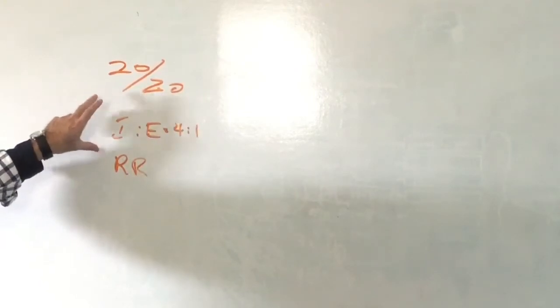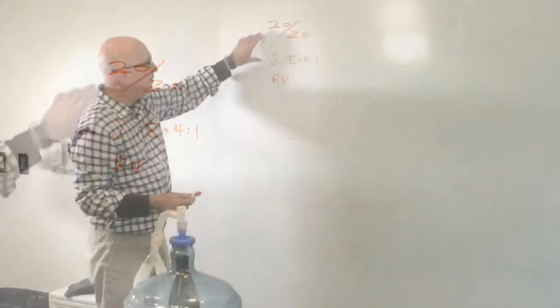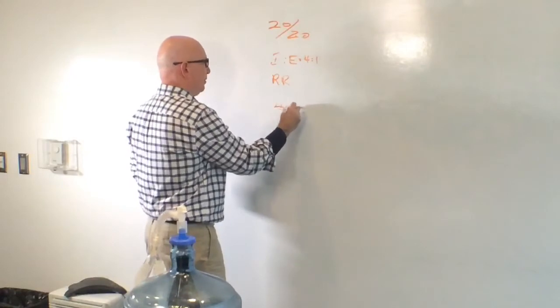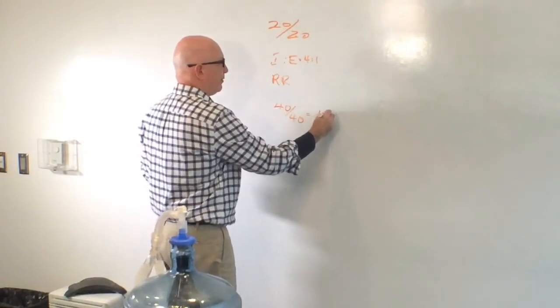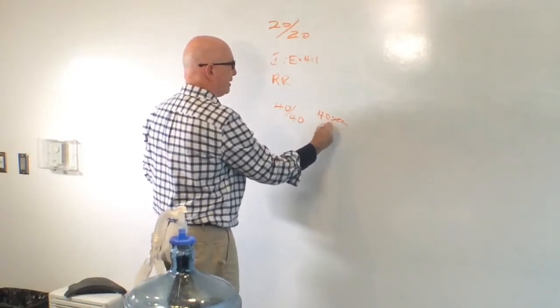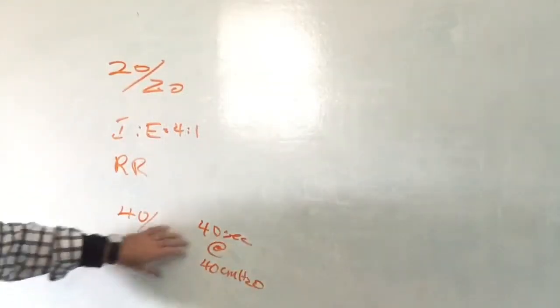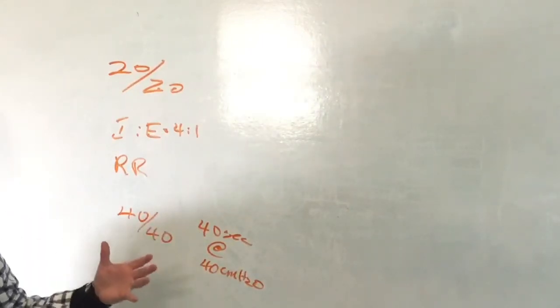Just to go through this quickly again, for those of you that may not be familiar with it, the point of this particular maneuver is because the LTV 1200 cannot do the 40-40 maneuver, which is the one that the literature talks about the most, which is holding the lung for 40 seconds at 40 centimeters of water pressure. And the idea behind that is if you give the lung enough time exposed to this kind of pressure, you're going to recruit alveolar units.